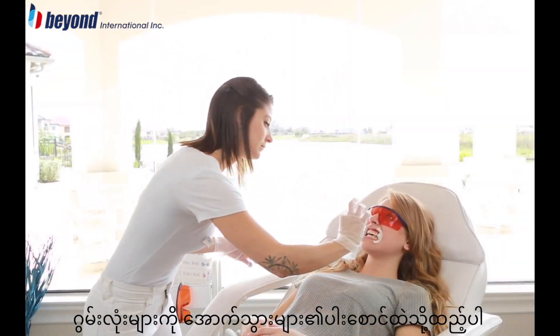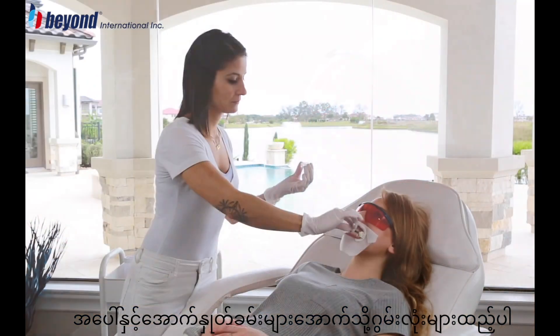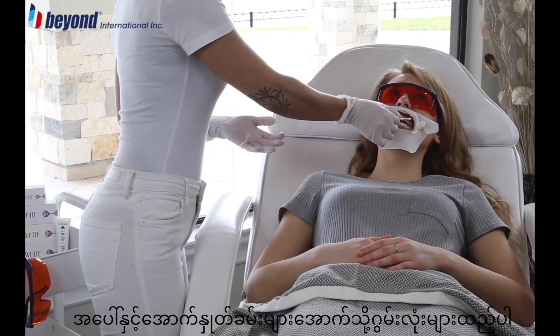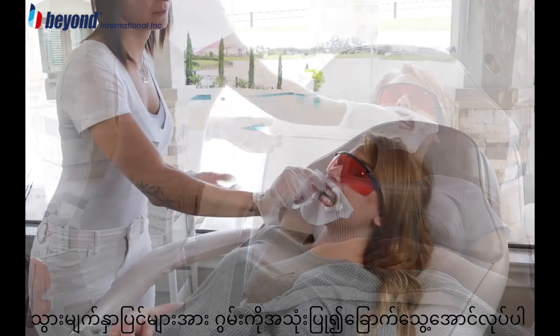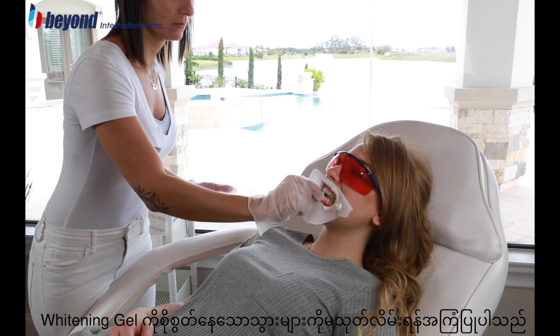Insert cotton rolls on the inside of the cheeks along the bottom teeth. Apply extra lip protection along the inside of the upper and lower lips. Use cotton balls or gauze to dry the surface of the teeth. Do not apply whitening gel to wet teeth.